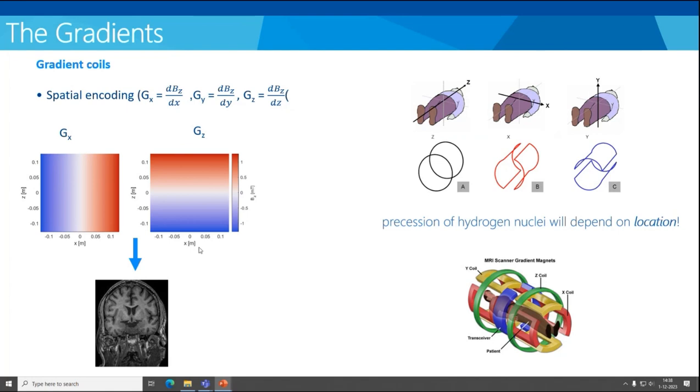So gradient coils are used for spatial encoding. In 3 directions, we vary the Z components of the main magnetic field. Not talking about other complicated nuance effects of fields here. What we do in space, we vary the fields, okay? And that's needed to create images.